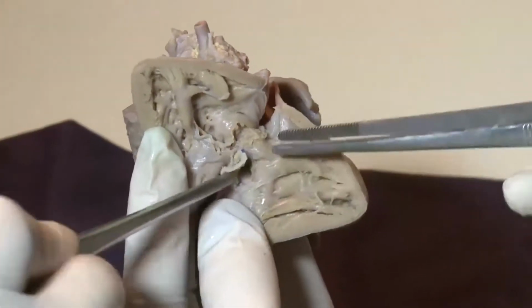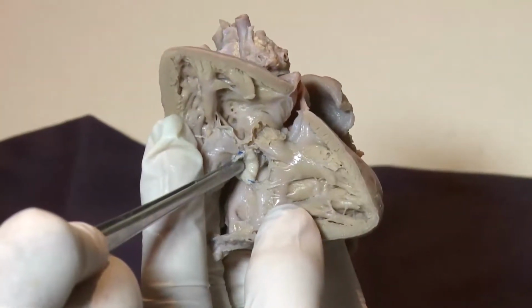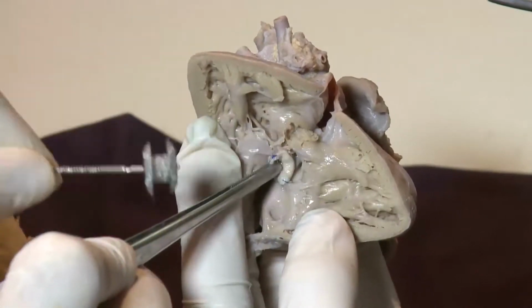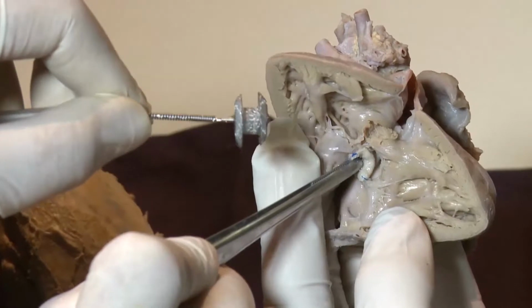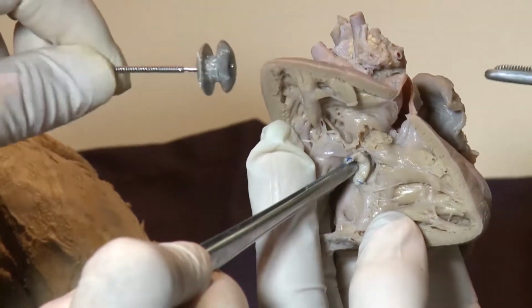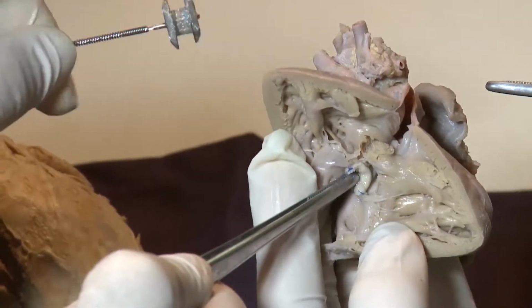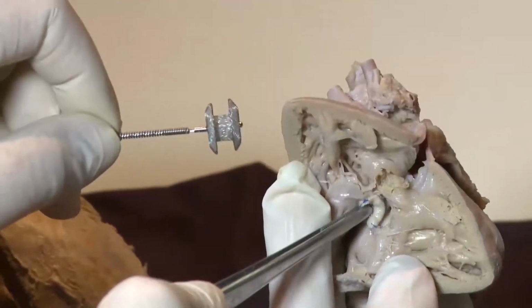So we are now closing this VSD by device instead of patch. This is a Cocoon device. This is similar to the AMPLATZER-1 and modified to close the perimembranous VSD to prevent the AV block. So it means it's softer and a little bit longer. Yeah, it's very soft.